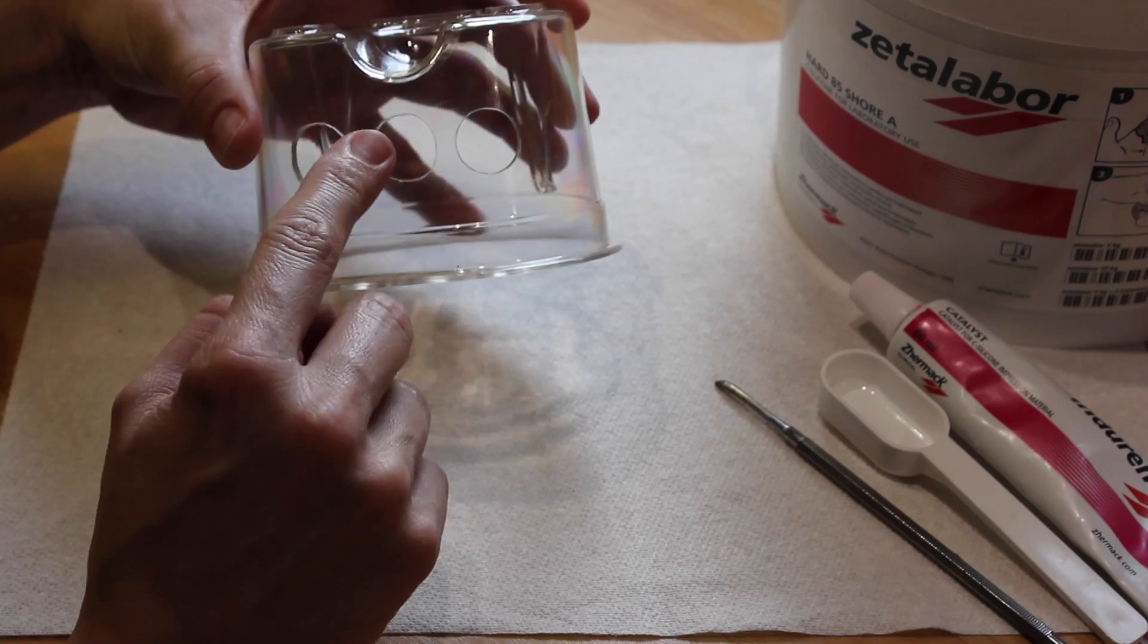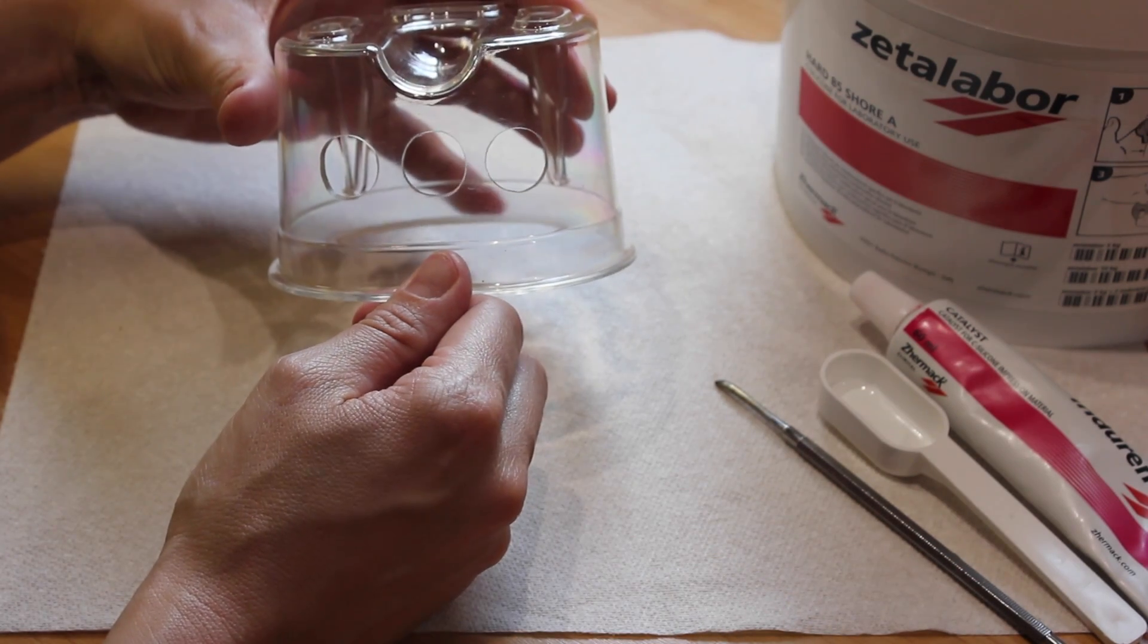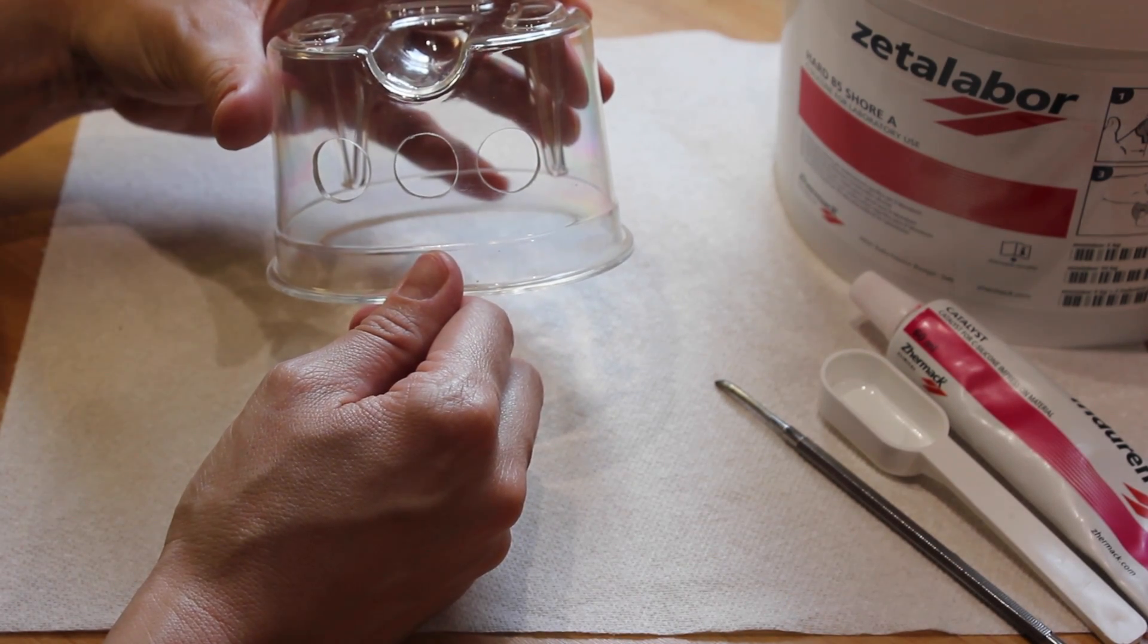So once the holes have been opened up and smoothed we can make a bung to cover all the holes while we're pouring in the silicone or the agar.